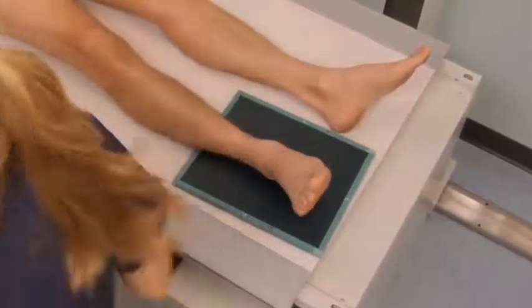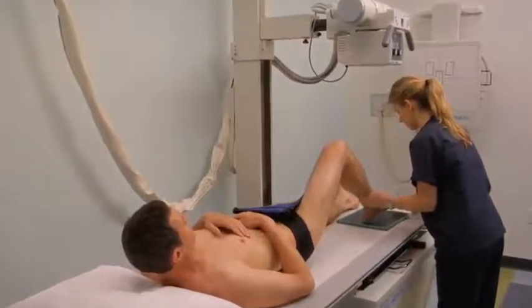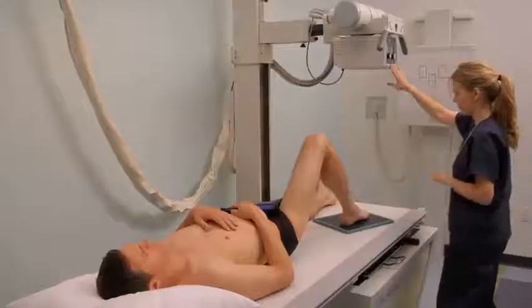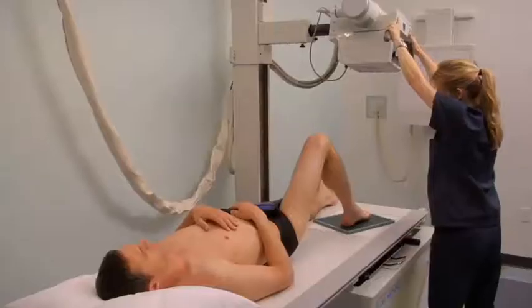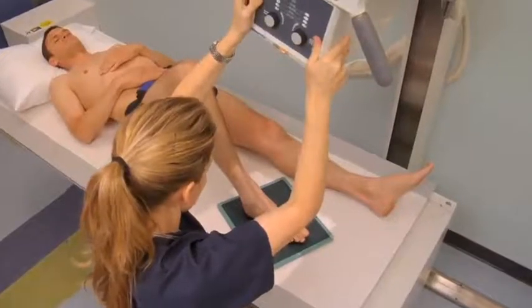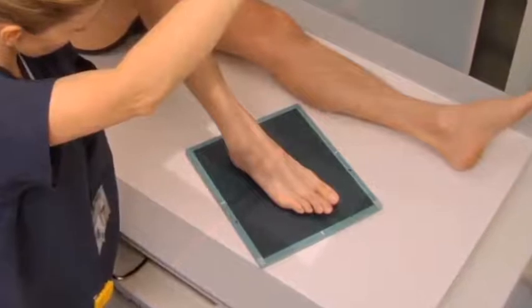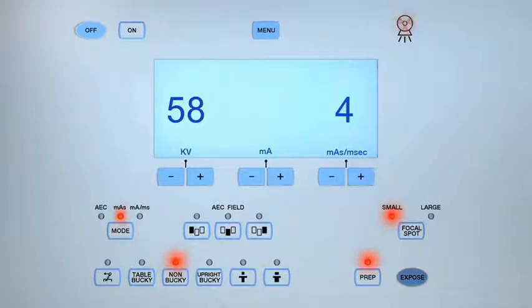To obtain an AP axial projection of the foot, place a 10 by 12 inch cassette lengthwise on the tabletop. The exposure factors are similar to those of the toe, except KV is 55 to 60 and MAS is 3 to 4. Ask the patient to lie supine and flex their affected leg; the opposite leg can either be flexed or extended. Align the foot with the center of the cassette. Angle the central ray 10 degrees cephalad, and set the angled central ray to the base of the third metatarsal. Collimate to include the phalanges, metatarsals, tarsal bones, and surrounding soft tissues. Place the appropriate lead marker and complete the radiographic exposure.